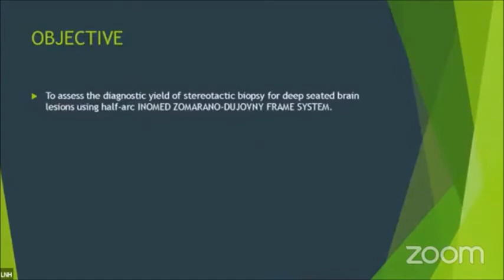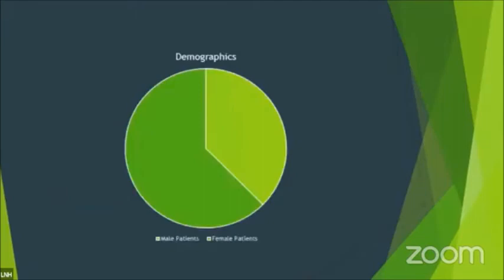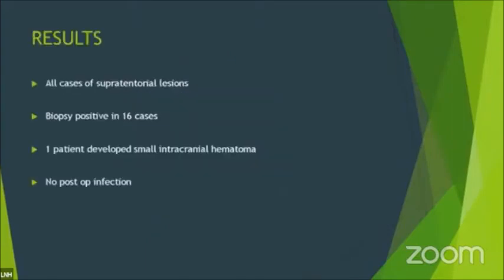The objective of this study was to assess the diagnostic yield of stereotactic biopsy for deep-seated brain lesions using this Amjad Zamorano-Dujovny half-arc frame system. We performed a retrospective case series. We included 16 cases from January 2019 to January 2020. However, we got slowed due to COVID. We could only include 16 cases, and histopathology was used for the assessment of the yield. Ten of our 16 patients were female, while 6 were male, and our biopsy results were 100% positive. All 16 patients showed a positive biopsy in histopathology.